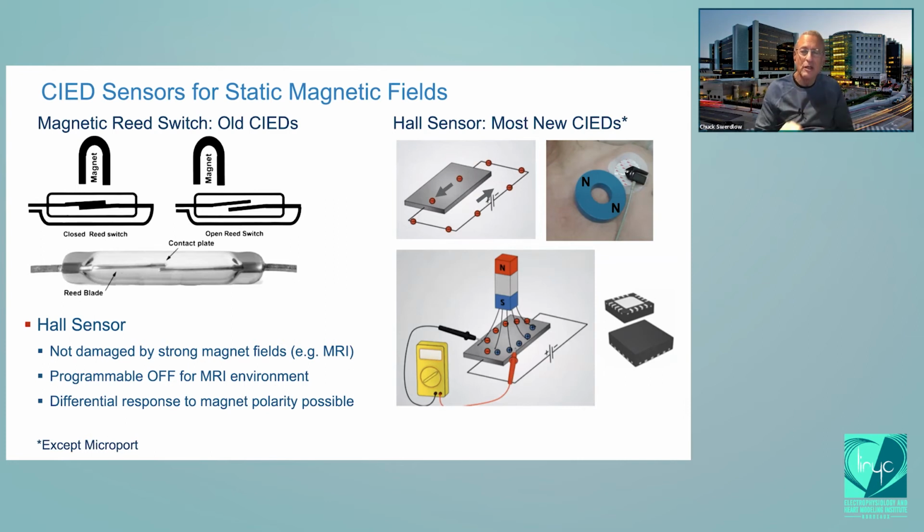You guys don't really need to know this, but the Hall effect happens when you apply a magnet to a conductor that is conducting in an electric circuit. And when electricity is flowing through the conductor, if you apply the magnet, the effect depends on whether the moving charges are positive or negative, and we all know that the moving charges in conductors are electrons.